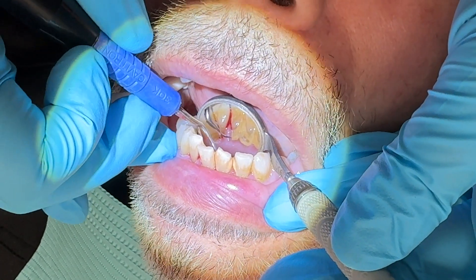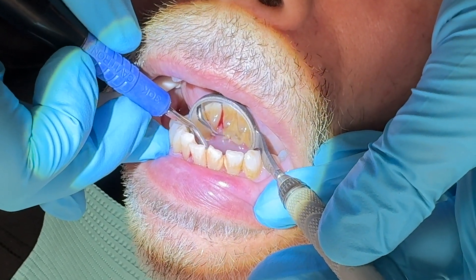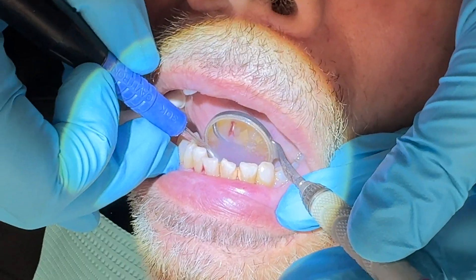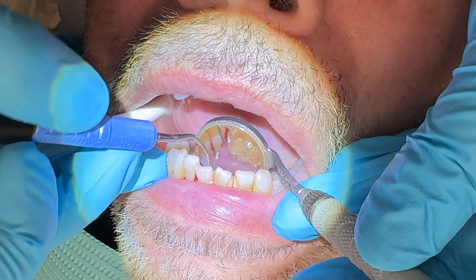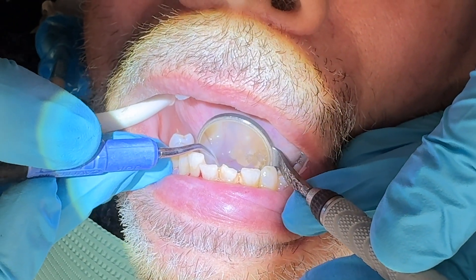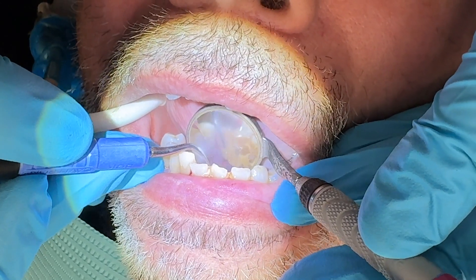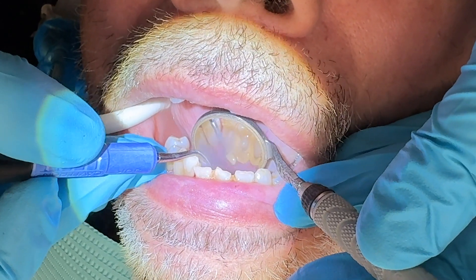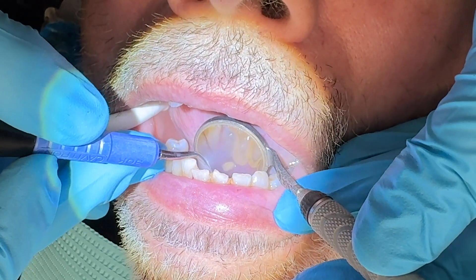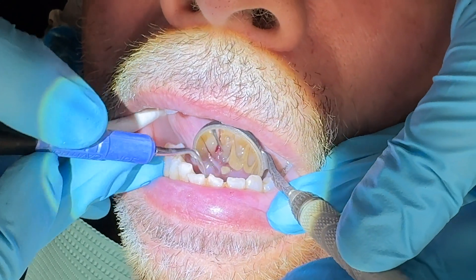So I'm going to start down here on the bottom — it just kind of breaks it off like that. But if I start at the top, it's going to get such bigger pieces, you're not going to burnish anything — it's going to be much more effective.